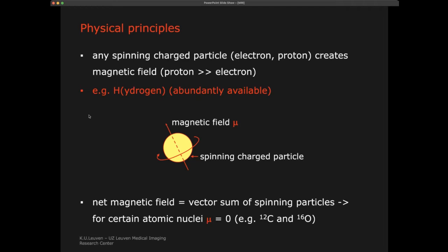And what we're actually doing with magnetic resonance imaging, as the term already says, is we look at magnetic properties of tissue. And the property we mainly look at is hydrogen. Why is hydrogen relevant? Because water, H2O, contains a lot of hydrogen, and our soft tissues have a very high water content, and obviously the blood has a high water content. So hydrogen is an atom which is abundant in our bodies, in biological tissues, and that's why we use it.